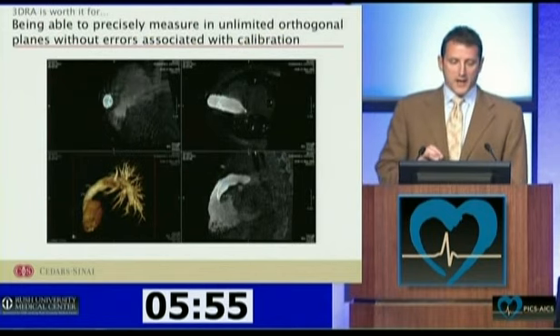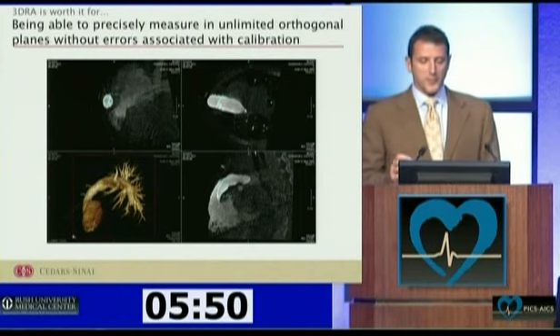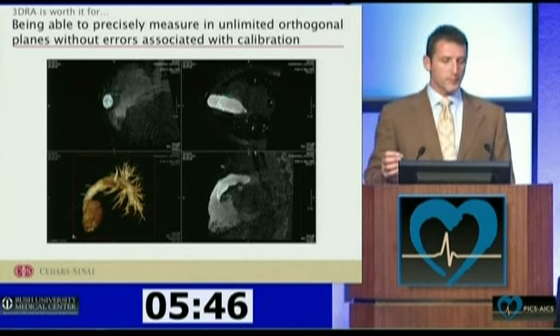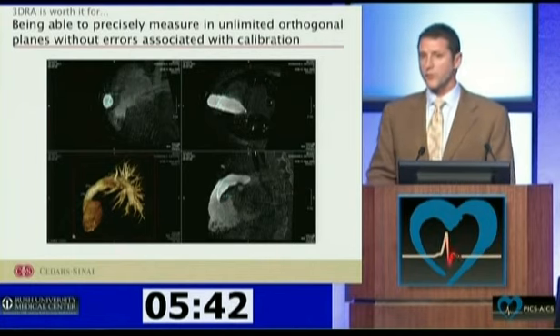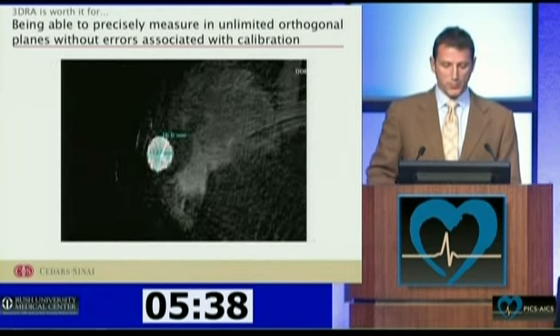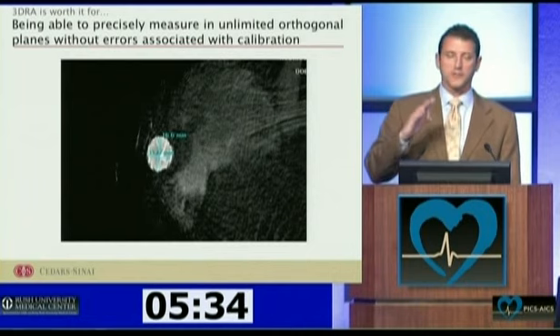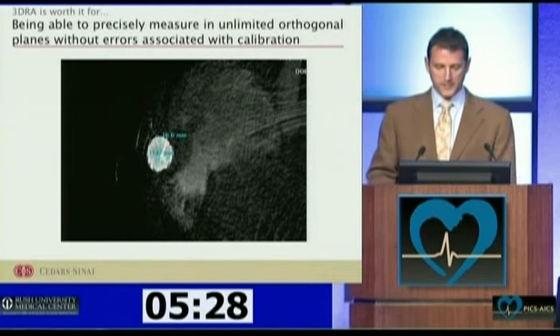This ability to obtain these unlimited orthogonal planes and measure in them without the errors introduced with calibration, I think is gigantic. And I have virtually gone to this for measurements where I don't think that dynamic measuring is as important. And again, being able to measure a stent result in 360 degrees with en-face assessment, that's just not something we do very well with two-dimensional angiography.